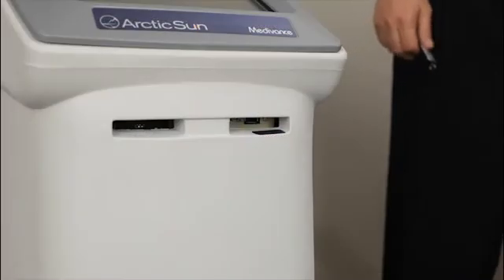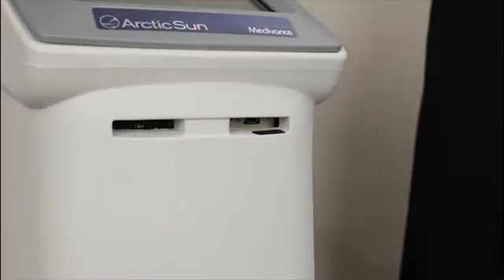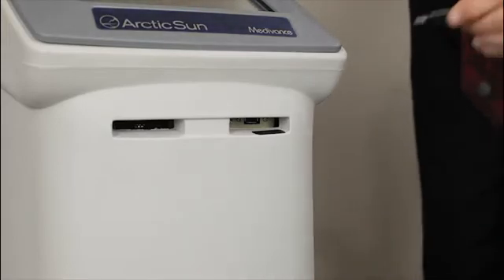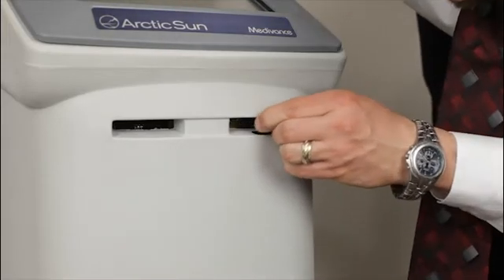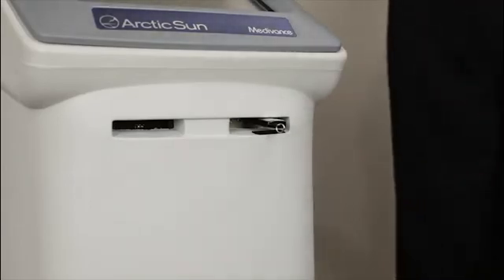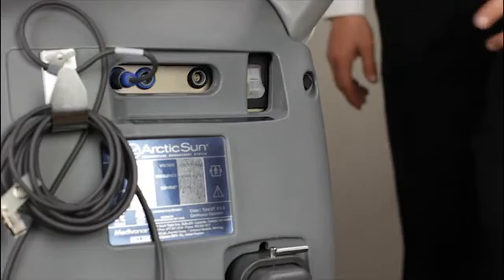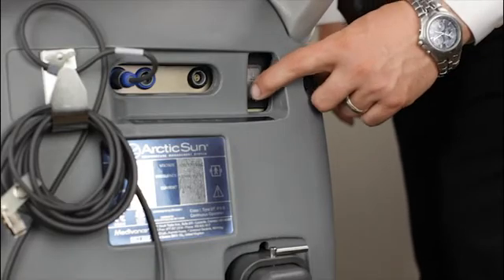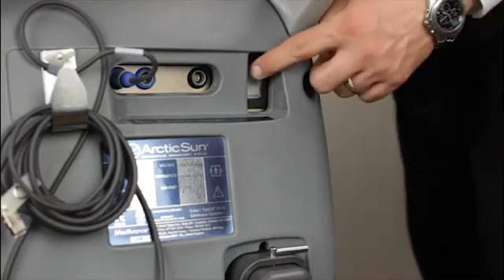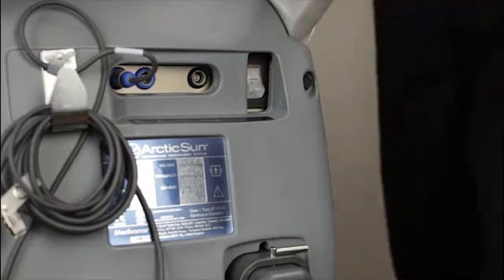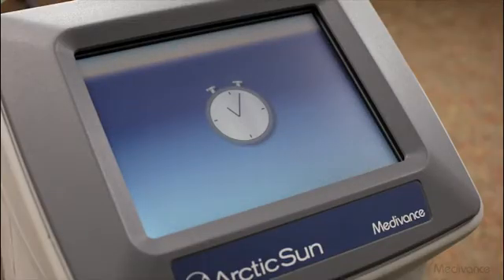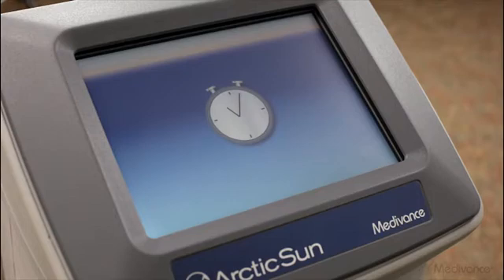To perform a software upgrade, insert the Medavance issued USB into the USB port on the front of the Arctic Sun 5000. Power the device off and power the device back on. A stopwatch icon will appear on the screen. The device will continually beep until the upgrade is complete.